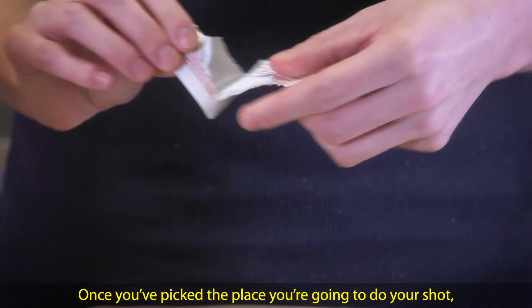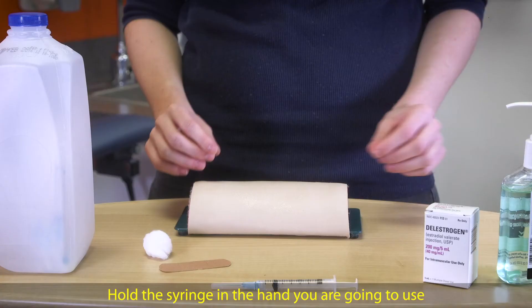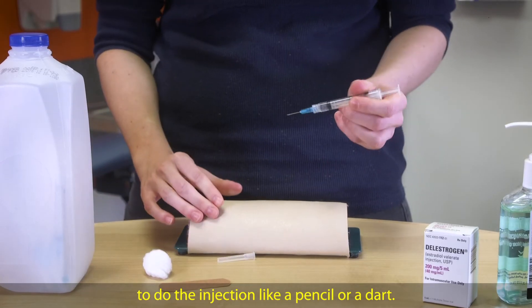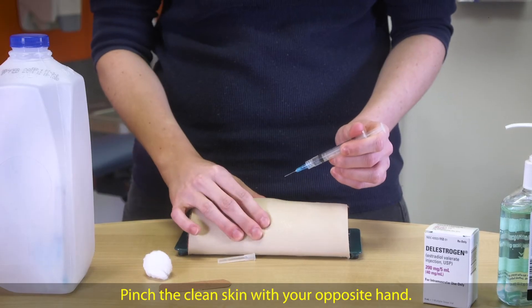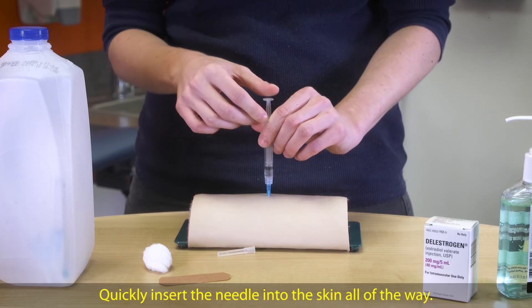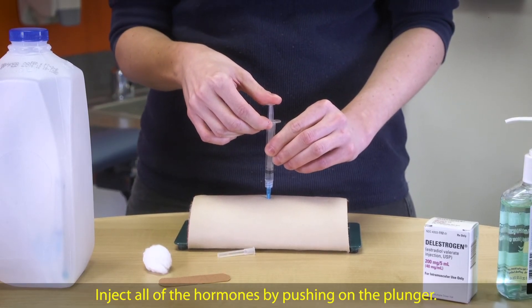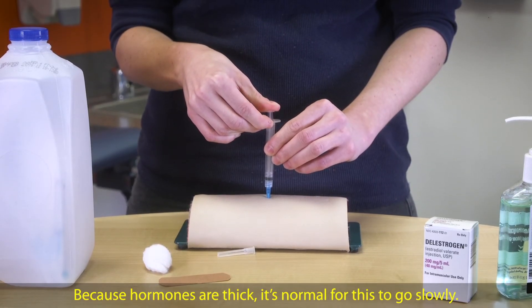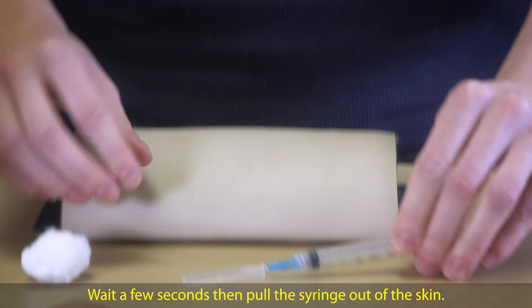Once you've picked the place you're going to do your shot, wipe off the area with alcohol. Hold the syringe in the hand you are going to use to do the injection like a pencil or a dart. You can insert the syringe at a slight angle or straight up and down. Pinch the clean skin with your opposite hand. Quickly insert the needle into the skin all of the way. Let go of the flap of skin you were pinching. Inject all of the hormones by pushing on the plunger. Because hormones are thick, it's normal for this to go slowly. Wait a few seconds, then pull the syringe out of the skin.